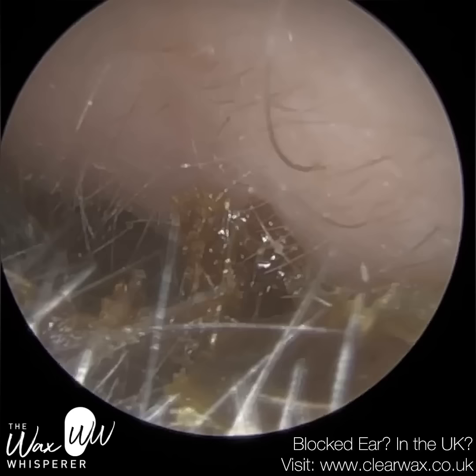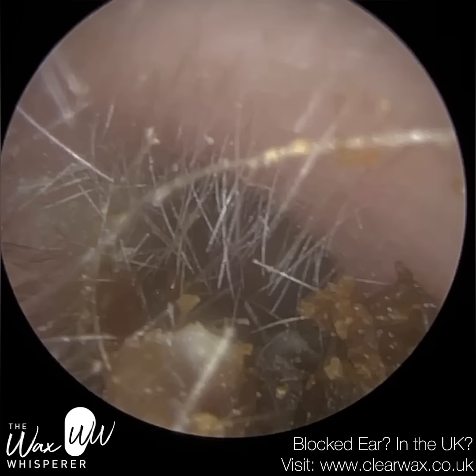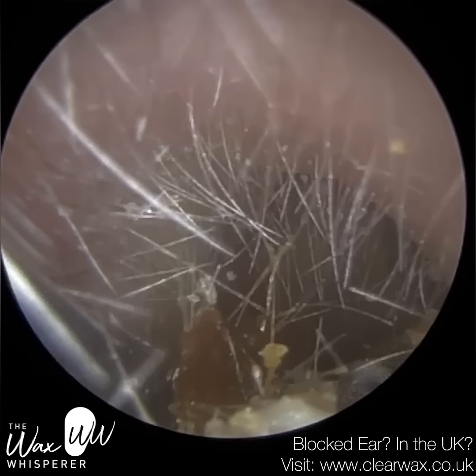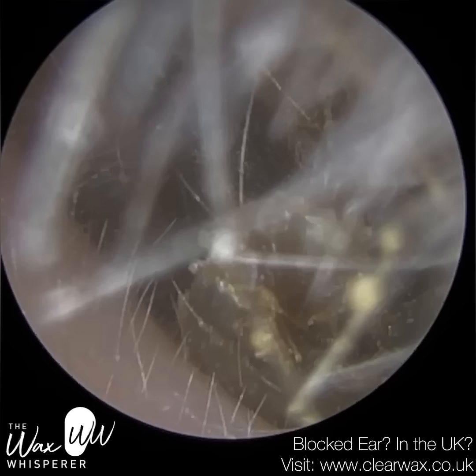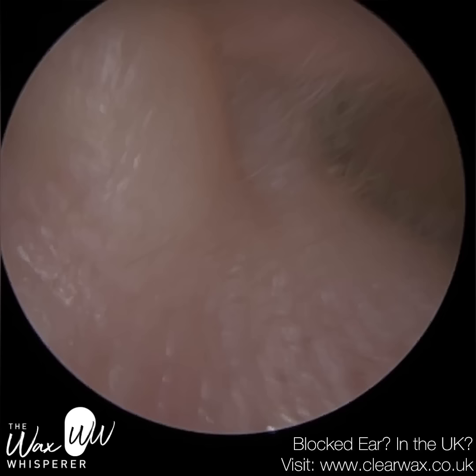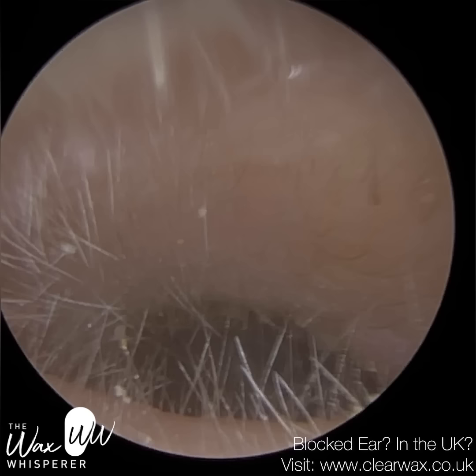I'm just removing this last piece of dead skin — it's just got trapped at the entrance. Now, once I remove this keratin plug, you'll see the patient's ear canal has a nice complexion, it's nice and pink. That's very different to their left side, so do stay tuned, because the left ear is the one the patient found extremely itchy. They were suffering from pruritus, which is the medical term for itchiness. The left side has a thick, adhesive layer of dead skin that had to be peeled away — so if you enjoy dead skin peels, do stay tuned.